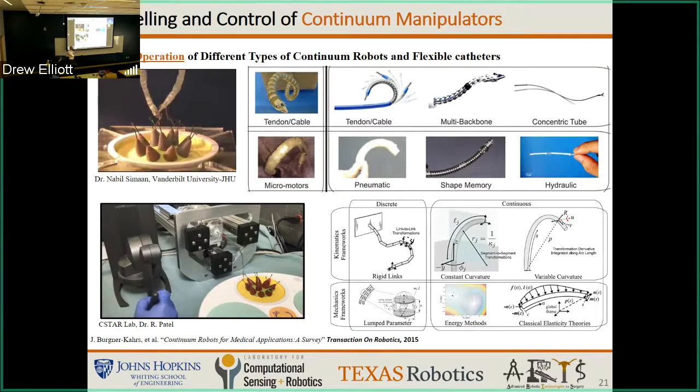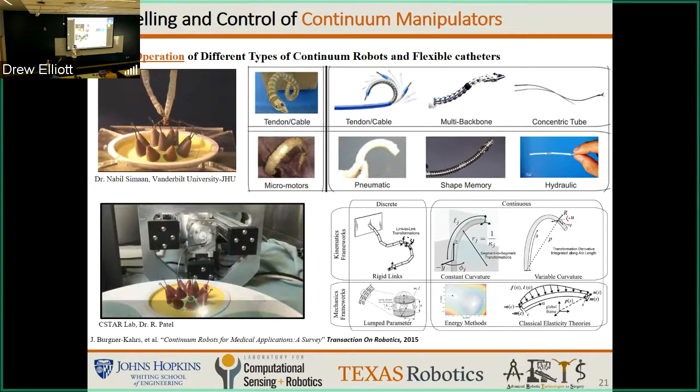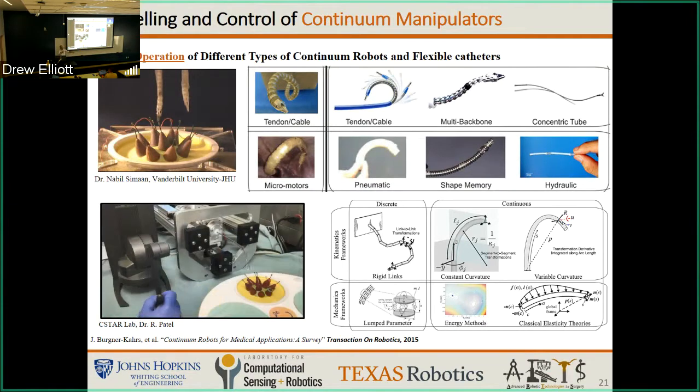So I want to change gears now and go back to another interest of mine, which is continuum robots. Continuum robots are deformable objects. Modeling the deformation is very hard, specifically once we are interacting with the environment and have external forces, so we can mostly do teleoperation. Basically, we rely on human intuition to compensate for that difference during control. Then I raised this question: if you want to do surgical autonomy with a continuum robot, can we do that or not? So then we tried it.